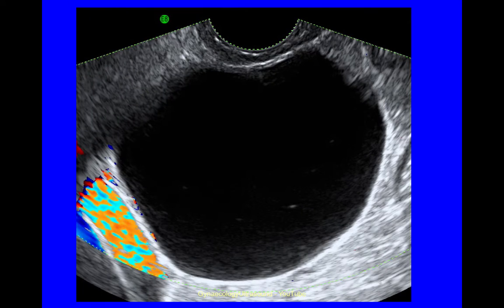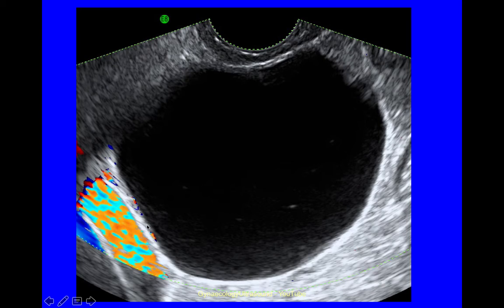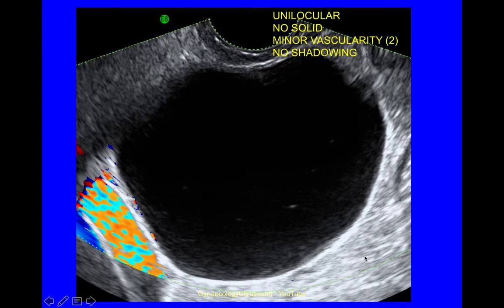This cyst is unilocular — a single locule, no solid material. If there were solid material that would make it unilocular solid, but this is unilocular. Minor vascularity, probably a little bit in the cyst wall, and no shadowing behind the cyst.